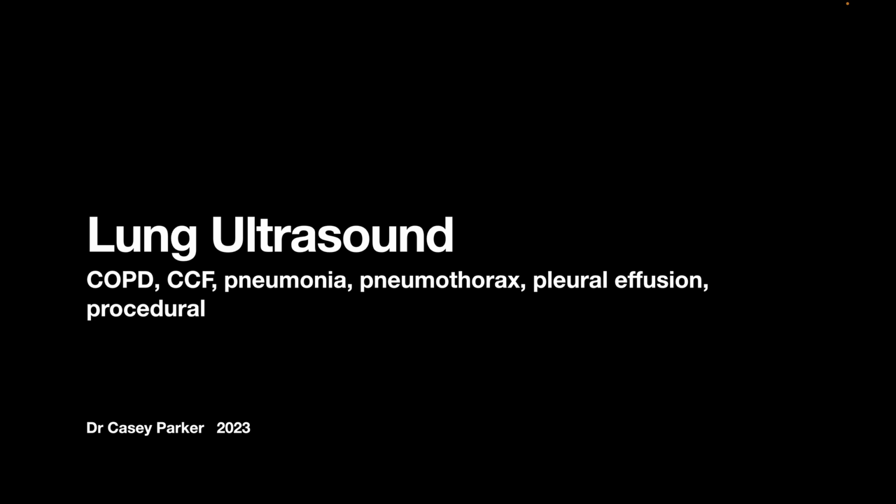In this talk we're going to cover all different parts of lung ultrasound, however we will not be specifically covering traumatic pneumothorax as that was well covered in the EFAST talk. So although there are medical pneumothoraces, the principle is exactly the same, so I'll refer you back to that last talk if you want to know about pneumothorax.